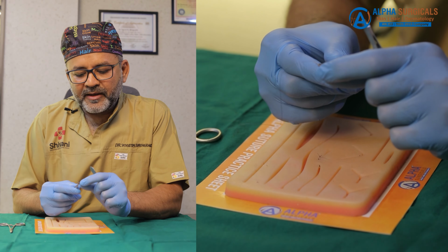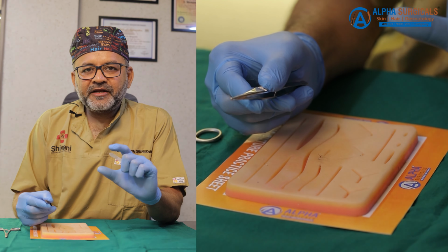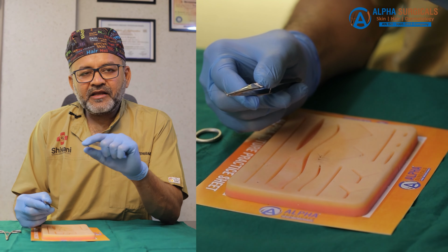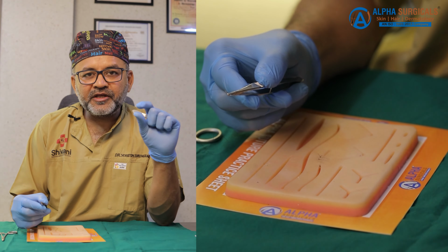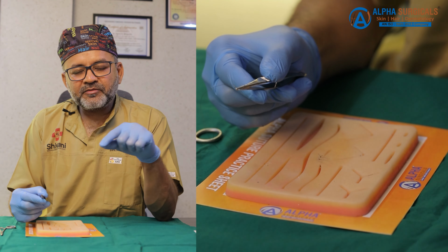So now I am going to demonstrate the running continuous sutures on the surface. Now where exactly do we need the running continuous suture? When we are closing the skin, if the thickness of the skin is too thin, there is no layer of fat, and the wound excision was not that deep.